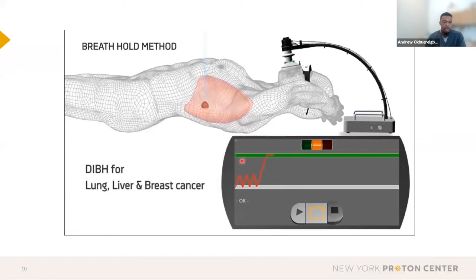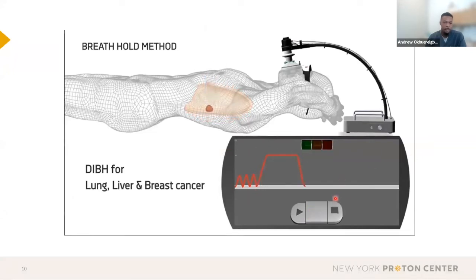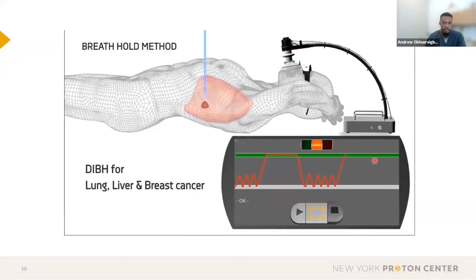As Z said earlier, during the SDX coaching session, they're instructed to know what these red lines indicate and what this green breath hold bar means. Throughout treatment, it gets to the point where we don't even have to speak to the patients about what to do next. They automatically know that when the green bar comes up, they can hold their breath inside that green bar, and if they need to breathe, they can breathe. We will only be imaging or delivering radiation when the patient's in that breath hold level.